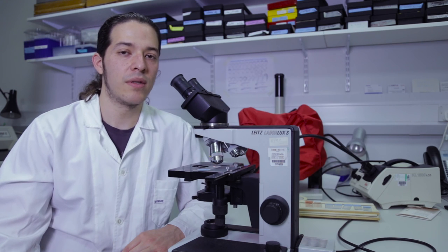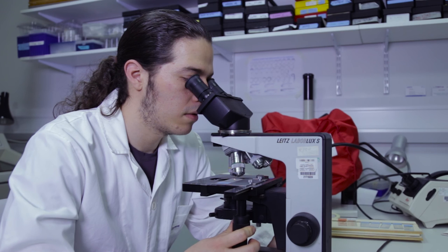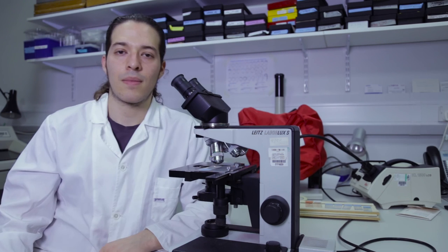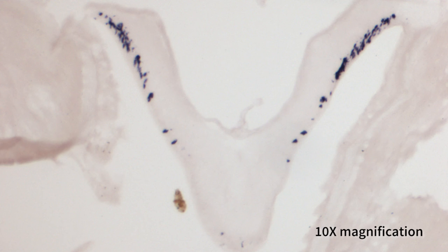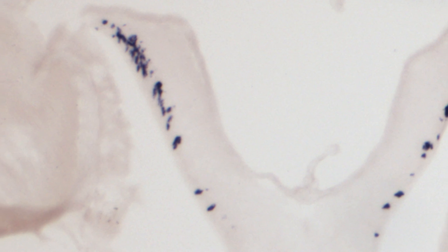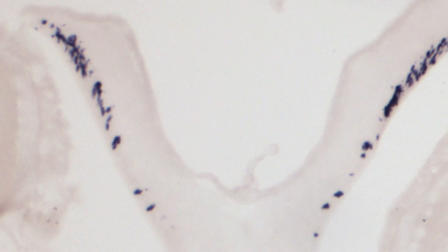Once the slides are mounted, we can view them under the microscope. Here is an image of the staining made earlier. You can see the expression of my target gene in the radial nerve cord of the starfish. Expression is visible as blue staining.